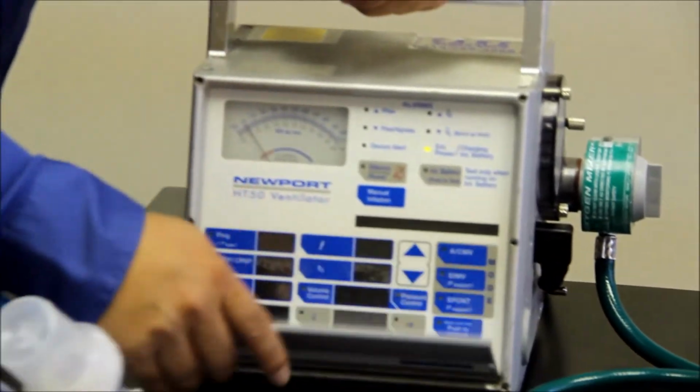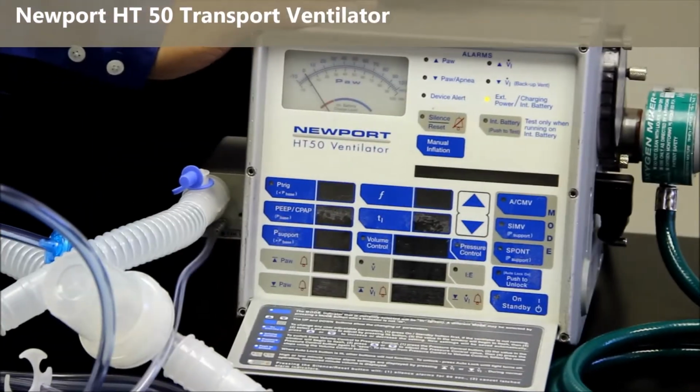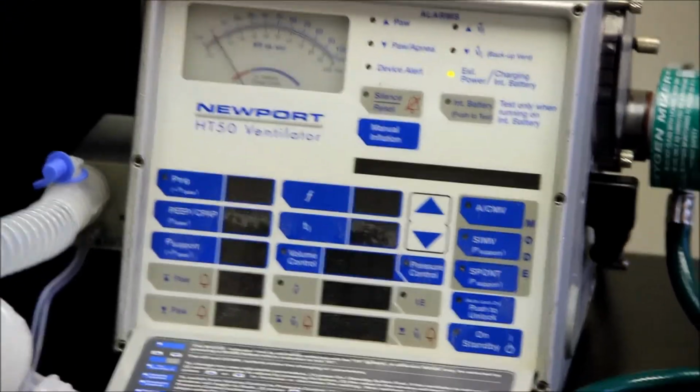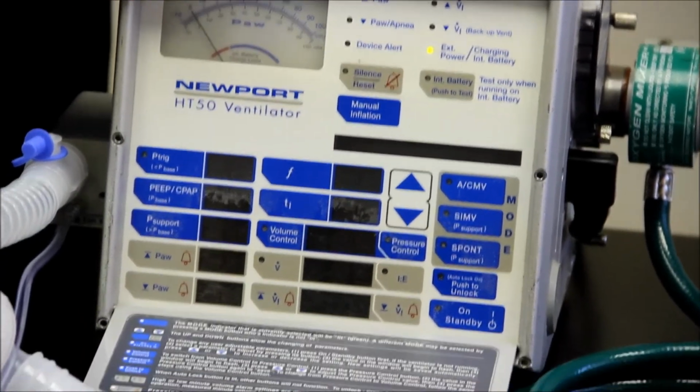So now that I've demonstrated that aspect, we're going to go through the basic modes of ventilation. So first off, this is pretty much a standard. This is called the Newport HT50. This is actually a transport ventilator, but we use this ventilator at the bedside as well. It's really small, compact, doesn't take up much space, and it actually can provide what we need for the patient.